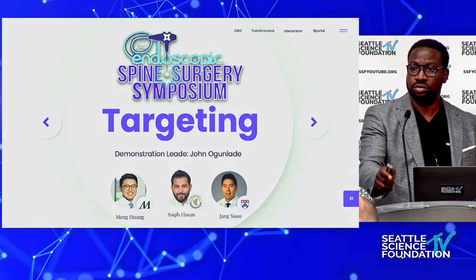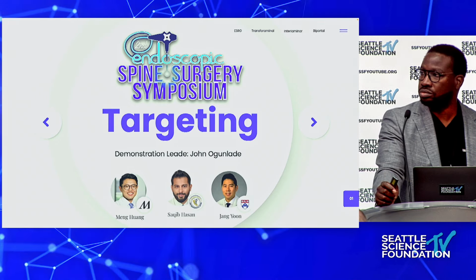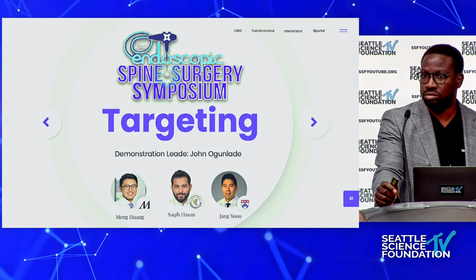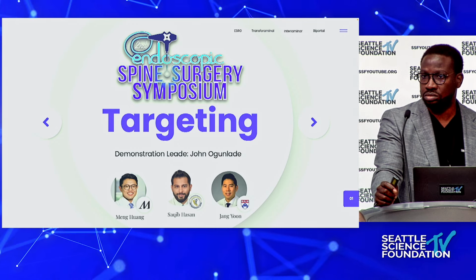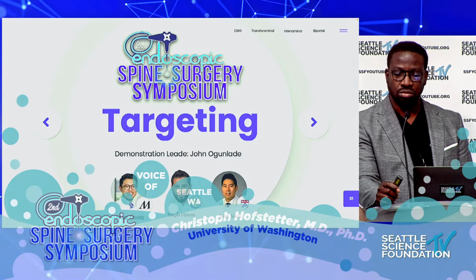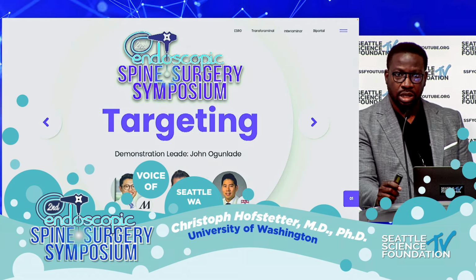Yeah. It was a large patient, and I thought I had a good x-ray, and I thought I was lined up, but it wasn't as perfect an x-ray as I thought. So once you get down there, you quickly realize that what you thought was the perfect x-ray actually needed a little bit of adjustment, and a few millimeters from a far distance will extrapolate and be centimeters at the target site. So that's what ended up happening. And that's a very common thing, having the x-ray not perfectly lined up. Super, super great example. Any other thoughts to share while we set up?